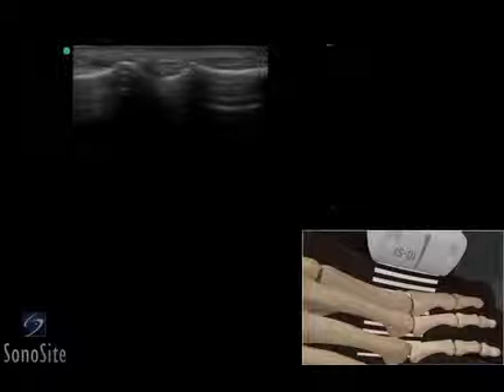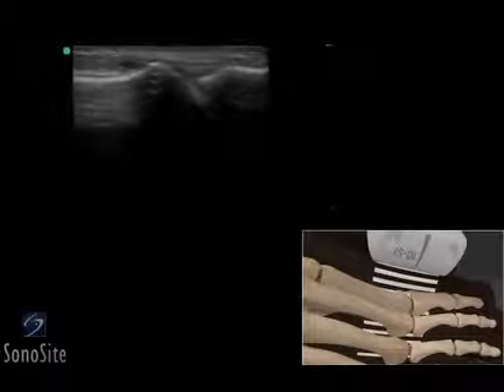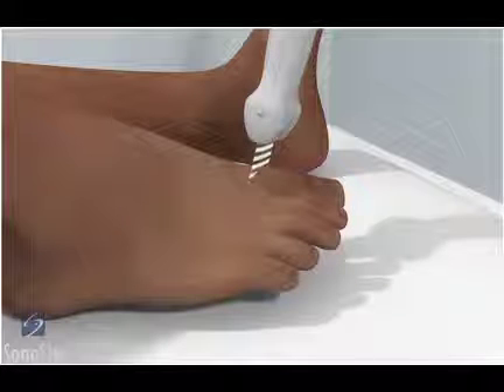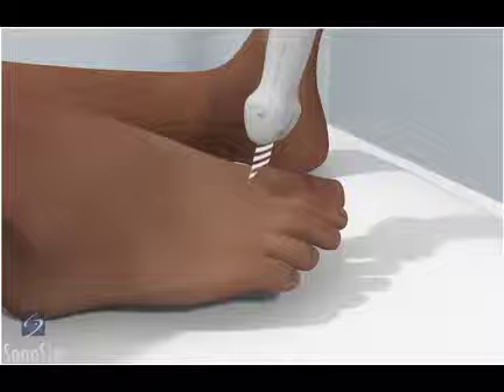A linear array transducer with a musculoskeletal exam type is used to perform an ultrasound examination of the metatarsal phalangeal joint in the foot. The patient is placed in a supine position with the knee flexed and the foot on the bed.